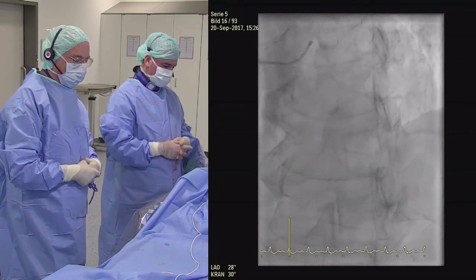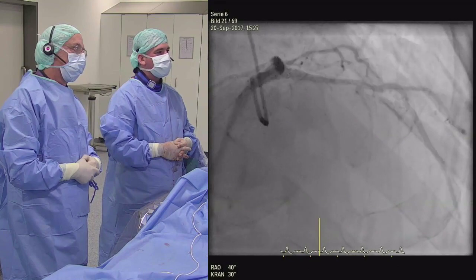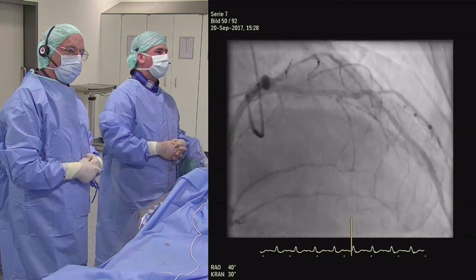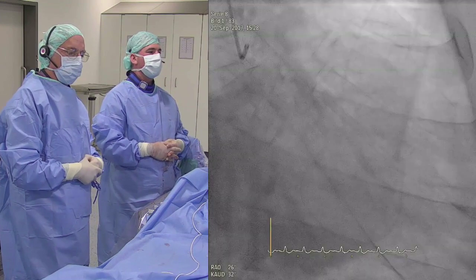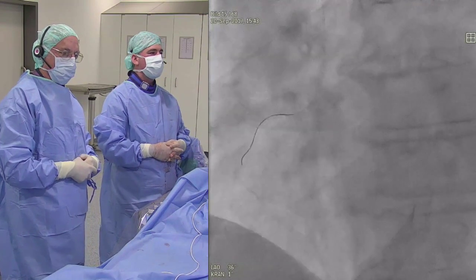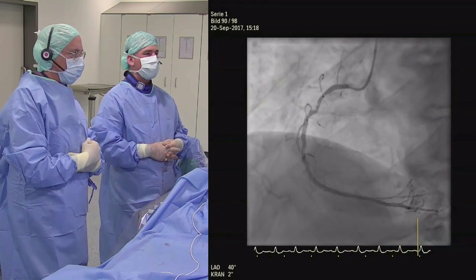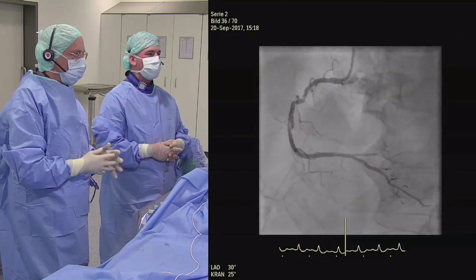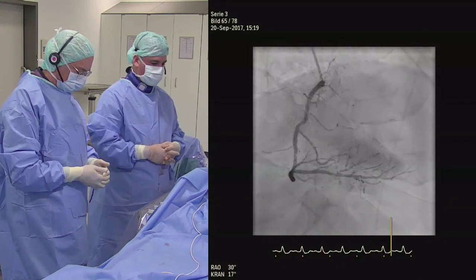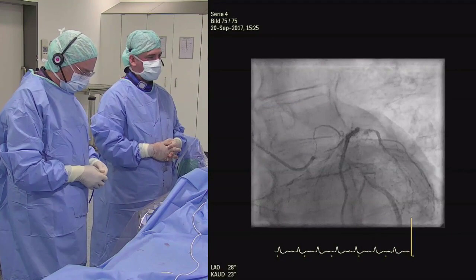No, not really a question. I just want to make a point when we are looking at the view from the lab on the left and the angiographic view on the right. When we go back to the live angio view, you may notice that the distal tip of the Opsens wire, compared to the other pressure wires, is 35 millimeters long. I understand from the engineers that at the very beginning they wanted to improve the trackability of the pressure wire, but now they realize that a 30 millimeter standard tip is probably better, so in the next generation they will, I assume, shorten the distal tip to 3 centimeters.